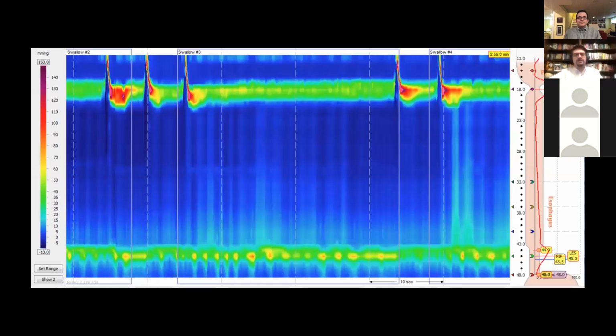So type 1 is essentially no peristalsis. You saw the scans Rob showed you. Here we see the initiation of swallow 3. The upper esophageal sphincter and the cricopharyngeus are working fine. It starts to swallow, but then nothing happens in the esophageal body, and there is no relaxation at the LES.